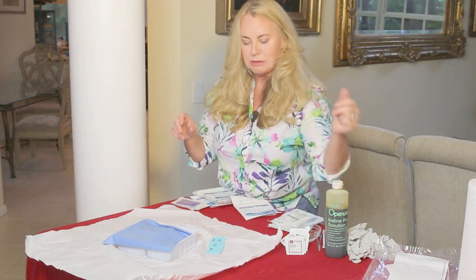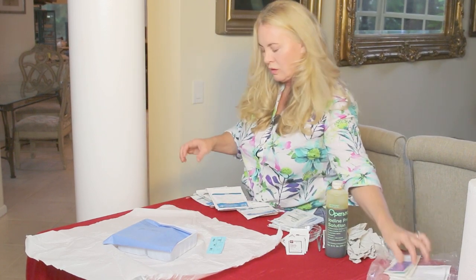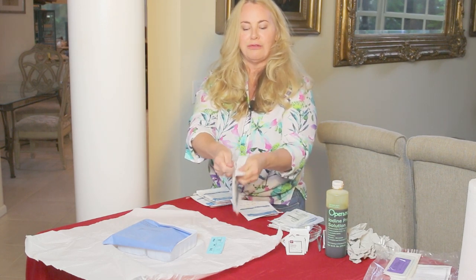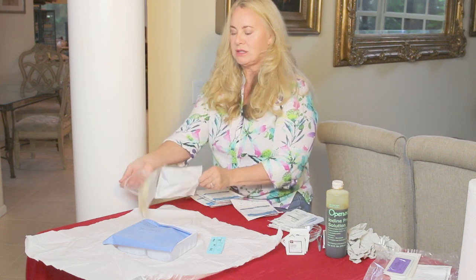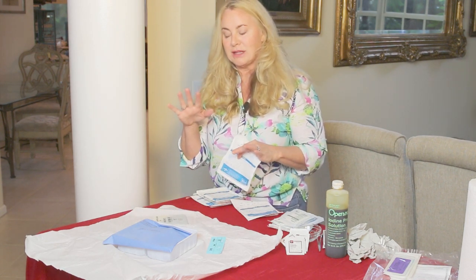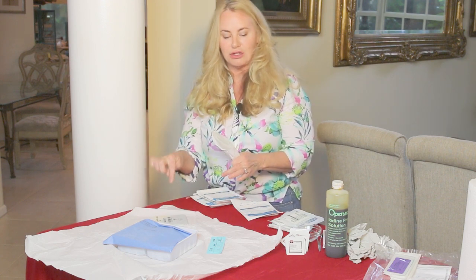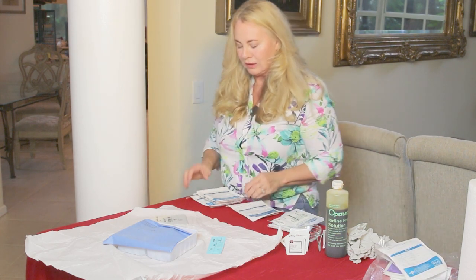The other thing you want to go ahead and open up is the gloves — the sterile gloves. Again, two sides: backing and front — pull it apart. You want to drop this in the corner because you're going to have to touch this with your bare hands to get the sterile gloves on. We're not going to contaminate the inside, but we are going to have to touch that package a little bit. The inside of that package is sterile, so we want to put that on the sterile field. That's a perfect location right in the corner.